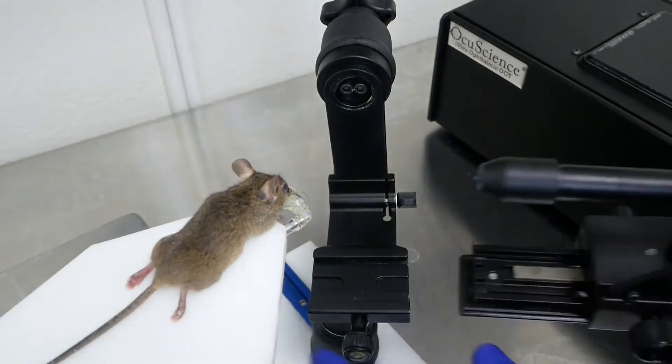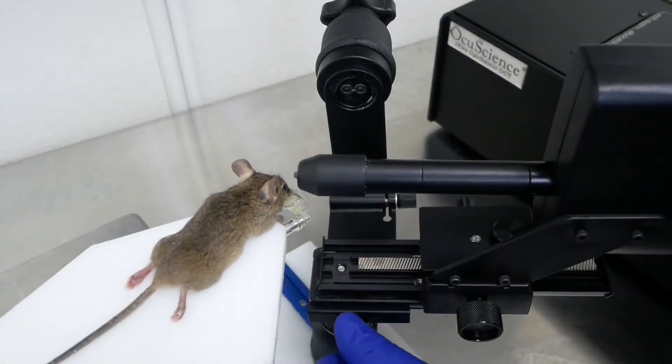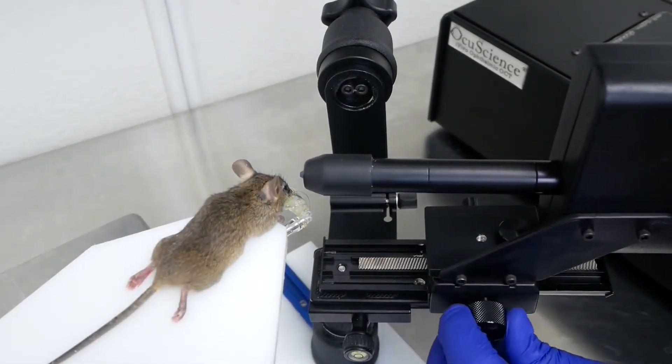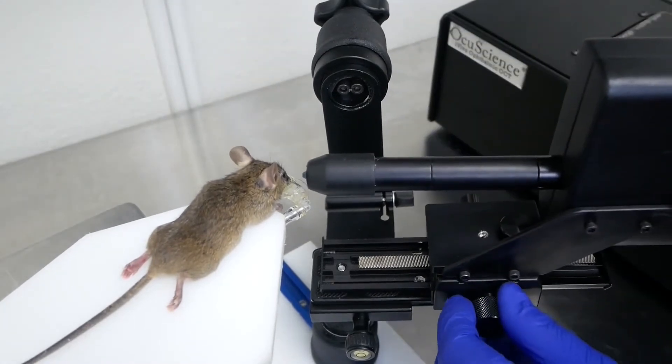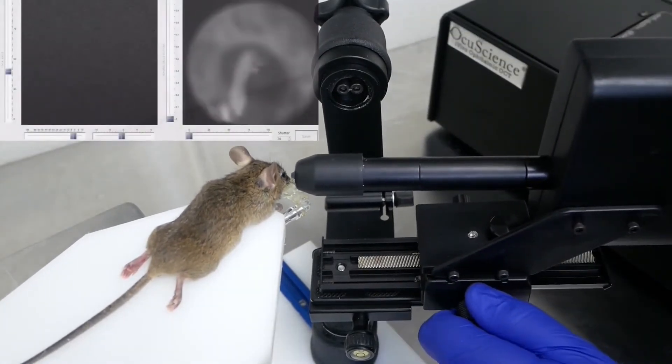The fundascope can be easily removed by sliding it off the rail and swapped with the OCT scanner head on the same rail to seamlessly transition into alternative imaging of the same eye and positioning.